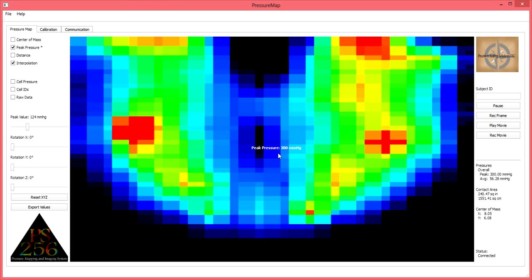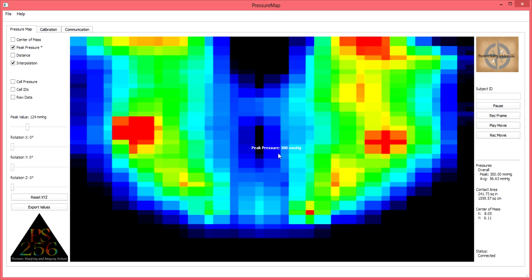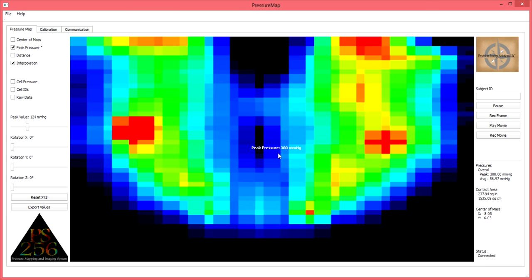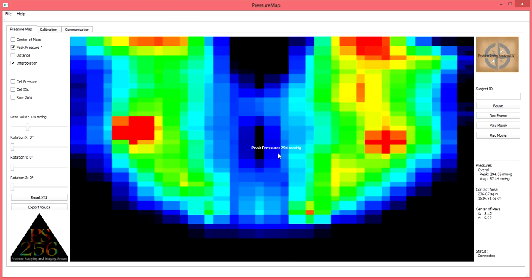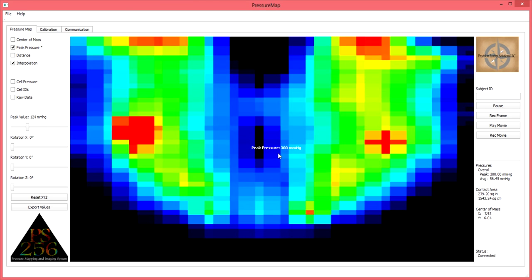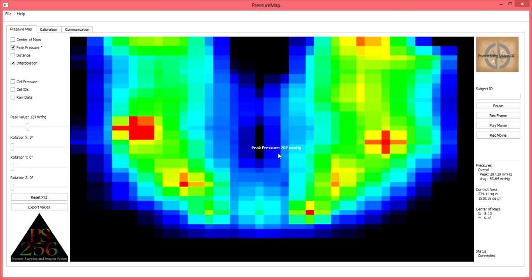If the user would like to identify the amount of pressure being exerted within a certain area, for example over an ischial tuberosity, they may incorporate two fully adjustable peak pressure boxes simultaneously on the system.